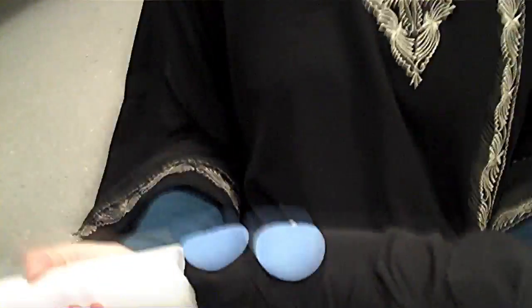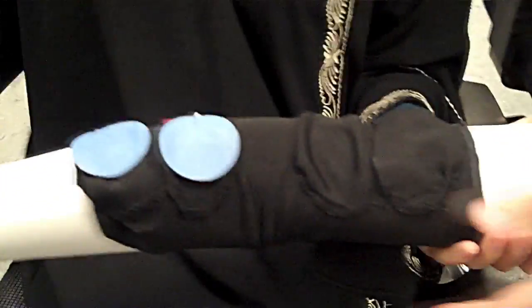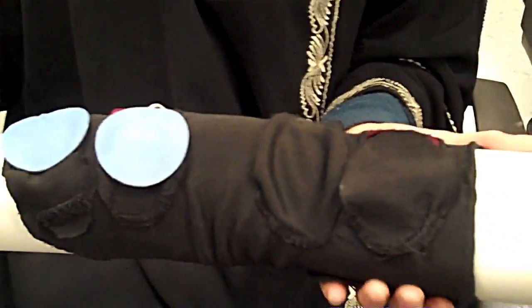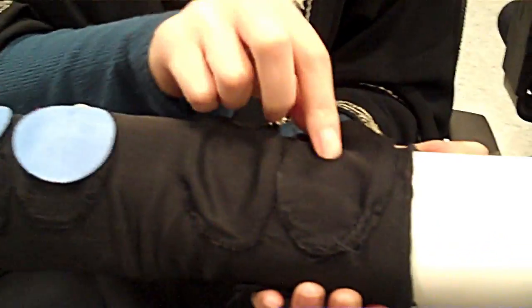We're here in the biomedical engineering lab with the NeuroBridge group. I am a biomechanical engineer working on the NeuroBridge device. The sleeve itself slides on to rehabilitate patients with ALS, stroke, and other diseases.